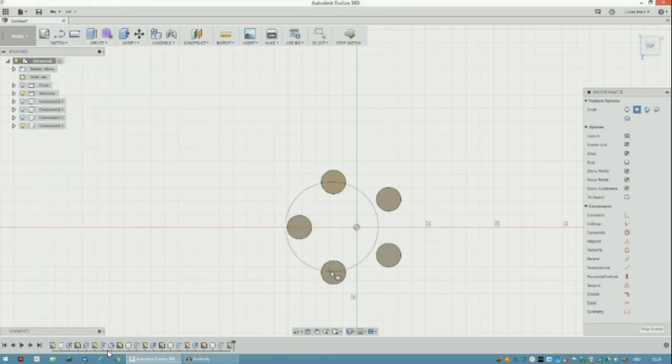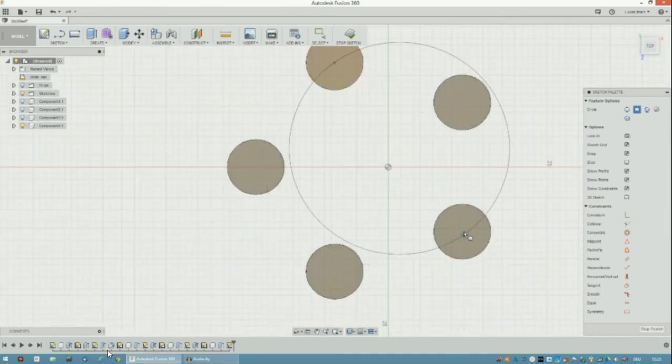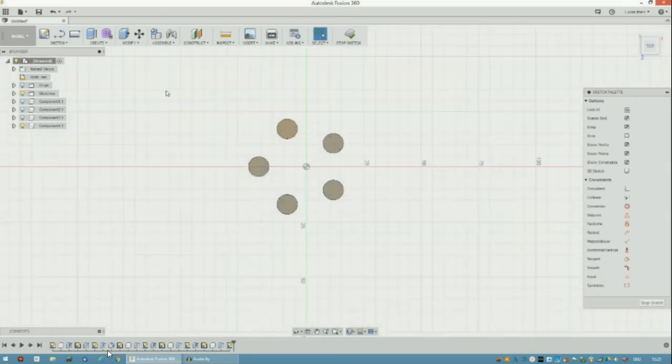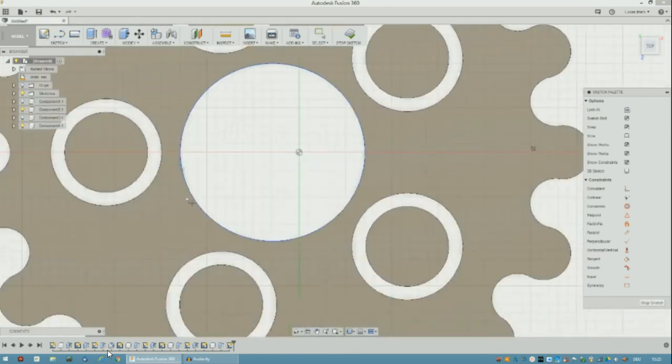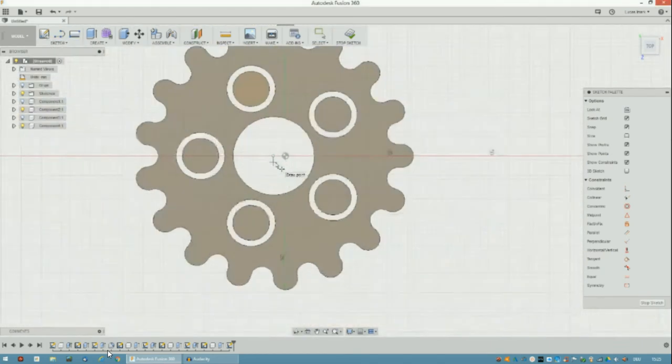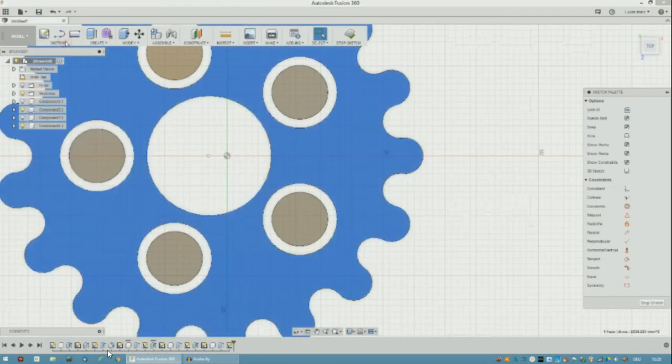I'm pretty sure that I'm not clear enough. So here I made a 3-point circle because I lost the center point. I could have done it better and easier, but that's actually what I did. So yeah, I was trying around, I was tired, it was late at night, I think, because my computer clock is a little bit offset.